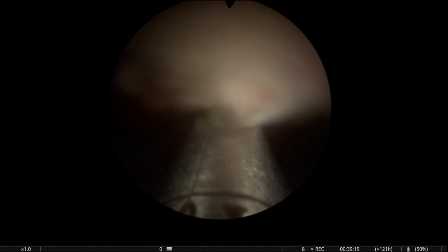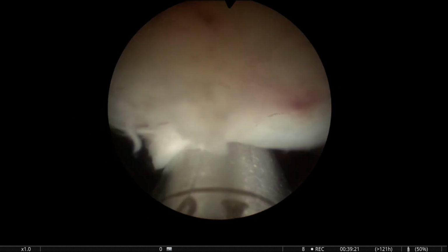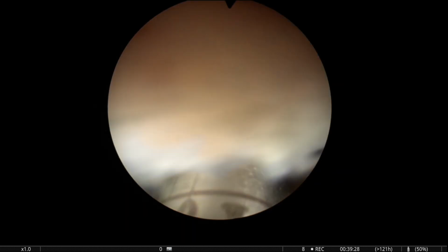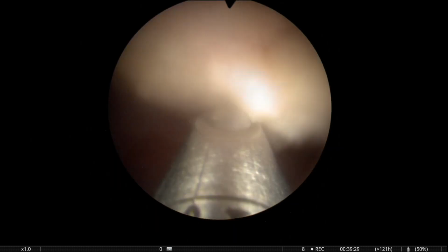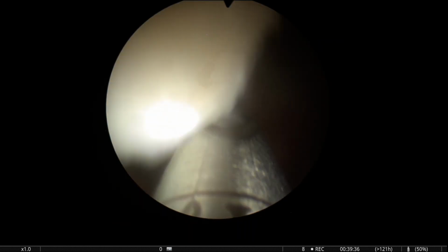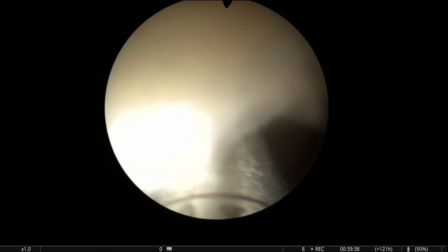Also, the tissues sometimes are very hard compared to other tissues, so we see some variability in the quality of morcellation. What happens almost always is that during morcellation the visibility is going to decay, unless you do perfect hemostasis, which is not always easy or achievable, and that's why you need a relatively fast morcellator.